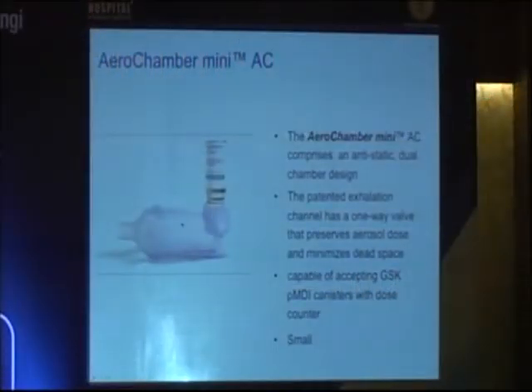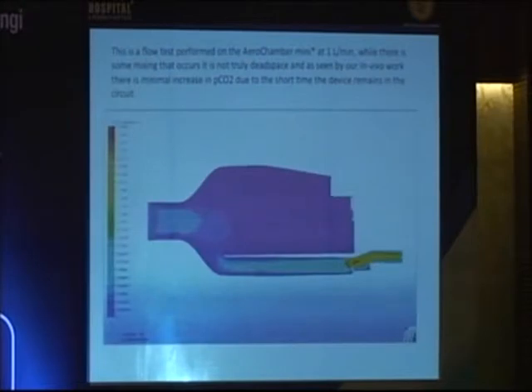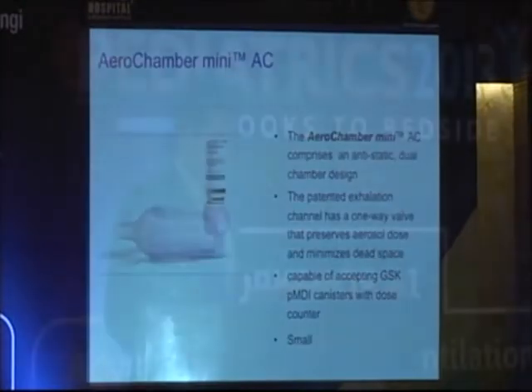anytime that you would use an inhaler and discharge the inhaler into the spacer, there's potential for a little electrical charge to occur, and that will reduce your drug delivery right away. That pulls that stuff right out of suspension. And by using a polymer that reduces the electrostatic charge and dissipates that charge, you can actually improve your drug delivery by upwards of 50%. So this spacer had to be something small also, because we tend to go into the isolette and give babies drug. So it had to be nice and small and lightweight.